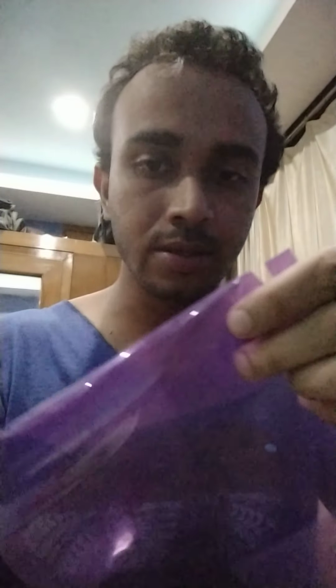So they have actually used OHP material for the shield, but instead of that, what you can use is, I'm sure everyone in their home has an old file which is not used. So you can use a transparent file. In my case, I have this file which I have cut into half. So if you cut into half, how this works is you just need to fold this like this and use the scissors, cut the edges here and here.